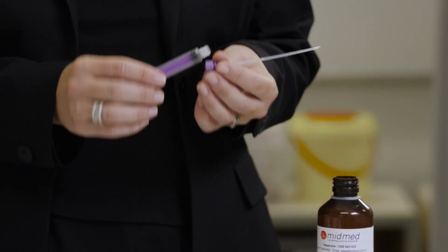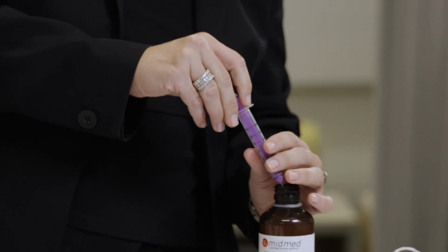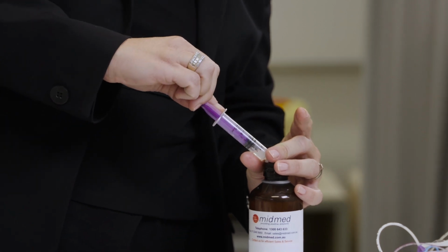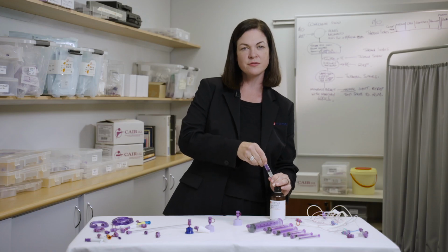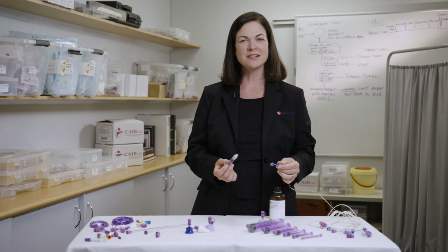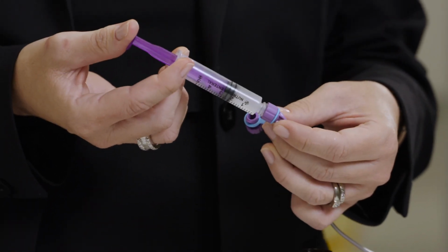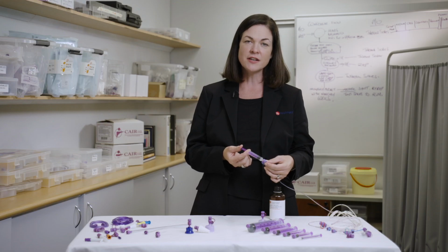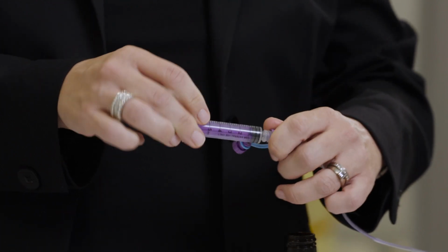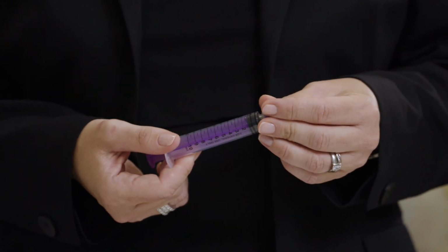When using the medication straw, firstly connect to the syringe. Then insert the straw directly into the bottle, pull the plunger back to desired dose, quickly cycle up and down as previously. Disconnect the straw from the syringe and gently tap to remove any remaining medication. To administer, move to the patient and connect the female Enfit connector of the syringe to the male Enfit connector at the patient's side. The design of the Enfit connector ensures there is no dead space, as the tip of the syringe is filled with the matched Enfit connector from the patient. When transporting medication, ensure a cap is fitted to the syringe.